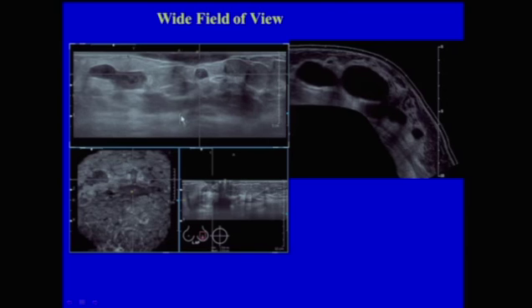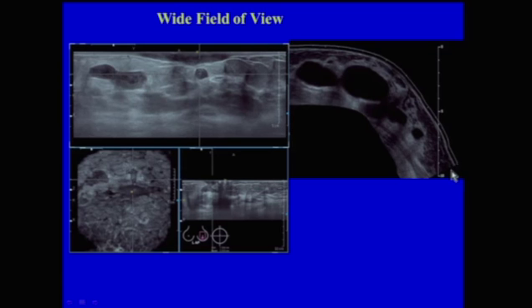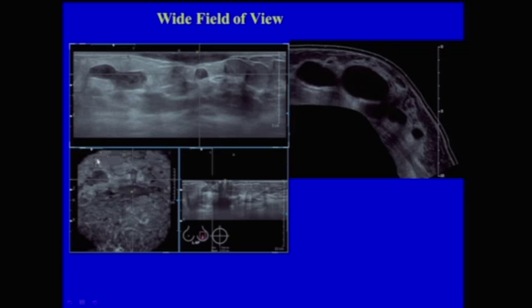Wide field of view can be very helpful in cases with multiple cysts, to see the relationship between one mass and another. The panoramic view can be obtained with most machines. The automated breast ultrasound unit shows a field of view extending 14 centimeters, where you can see multiple dilated ducts with hypoechoic material, also seen in the coronal projection in a patient who had multiple abscesses.